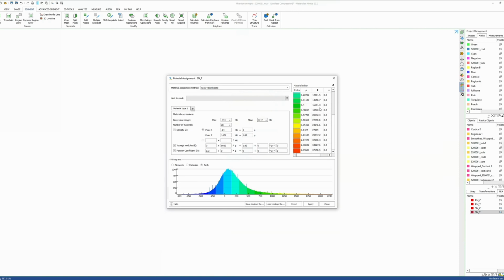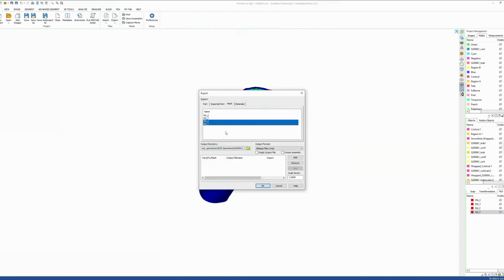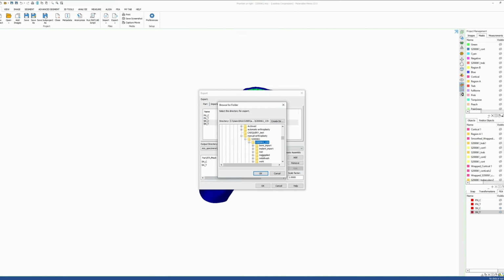Prior to proceeding, just make sure you do a logic check for your assigned Young's moduli. Here I've seen that my assigned Young's moduli from my relationship exceeded 20,000 megapascals. As I know from the literature, it's rare that trabecular bone Young's modulus would exceed 20,000 megapascals, so I'm just setting a manual limit here. Now, go ahead and export those new material applied model files.